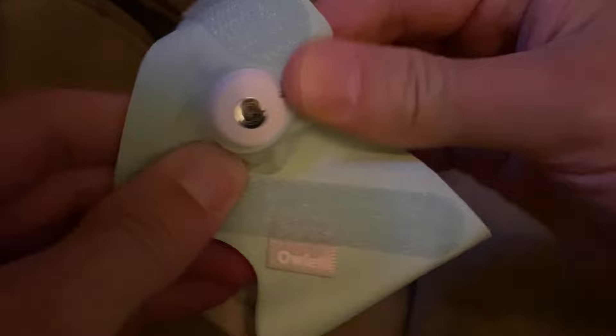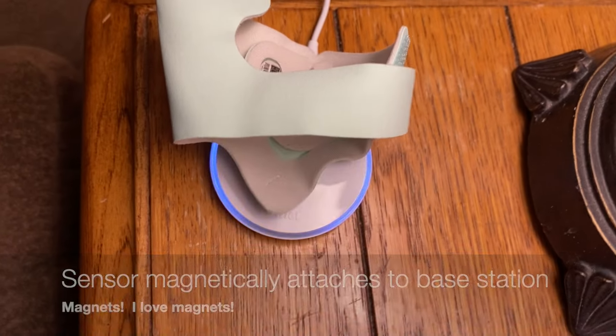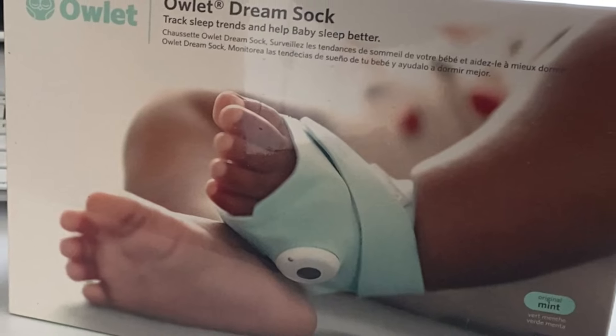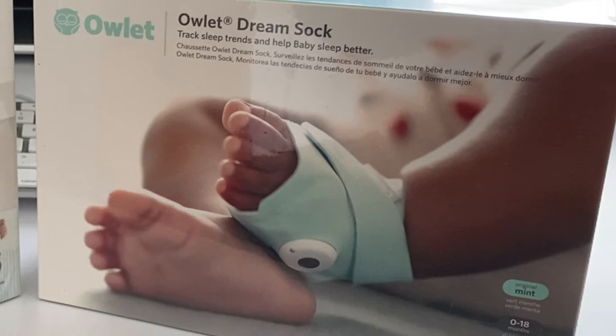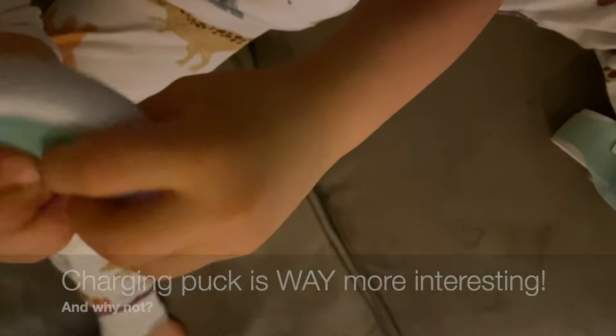The sensor is built to magnetically attach to the base station — the part that sticks out goes into the divot on the base station and snaps in magnetically. We didn't have much luck getting a good picture of what it looks like on, so I'm going to use the box to show how they've put the sock on the baby for monitoring. This one found the charging puck way more interesting than the sock.